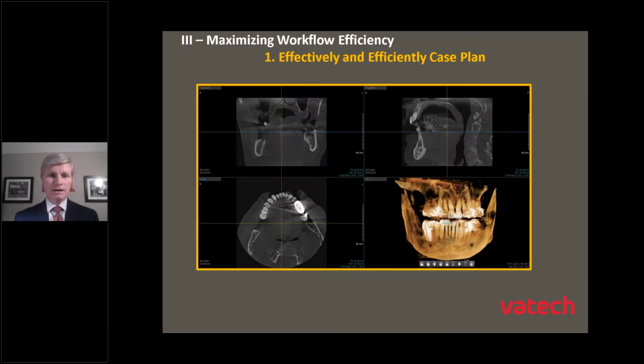Maybe perhaps Parkinson's may be a factor in making it more difficult for the patient to stay stable. There are a lot of offices that I've been to that keep a chair in the exam room, or sorry, the X-ray room. When the patient comes in, I'll sit the patient down in a chair, bring the machine down to them, and take the CBCT scan that way. By removing that potential movement of the legs or knees and so forth, you increase the likelihood of getting a successful CBCT scan.